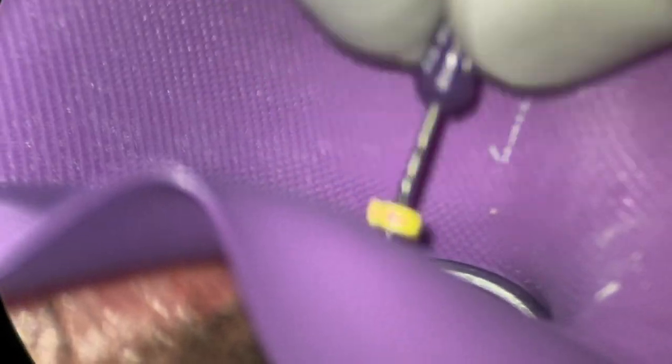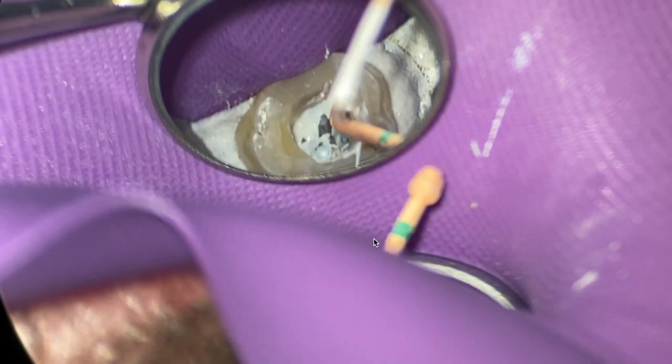One way I can do that—simplify, I don't know, makes a difference—but we started sterilizing those tips and they don't melt. I'm not sure if it makes a difference, but it kind of makes me a little bit happier. Essentially what happens with the BC sealer tips, they end up in a drawer. You know what I'm talking about, they end up in the endo cabinet drawer. So what we do is we put them individualized in bags, sterilize them. That just gives me a little more peace of mind. What I was doing there was I was popping, we inject into the coronal portion of the canals. I take a 10 file, break the air bubble, break underneath that. So I break it and then I coat the walls and I put a little bit of sealer on my gutta percha points. I'm not looking for tugback, I'm looking for apical stop so it doesn't go apically.